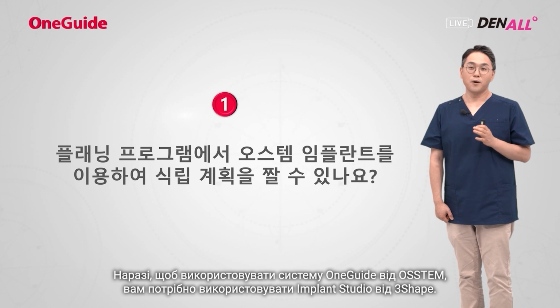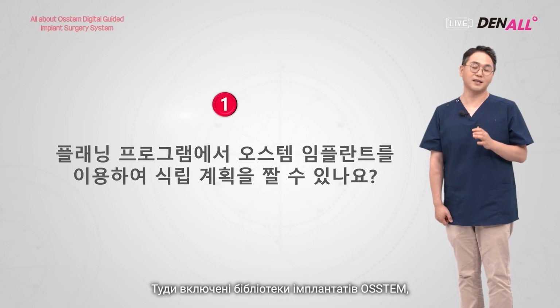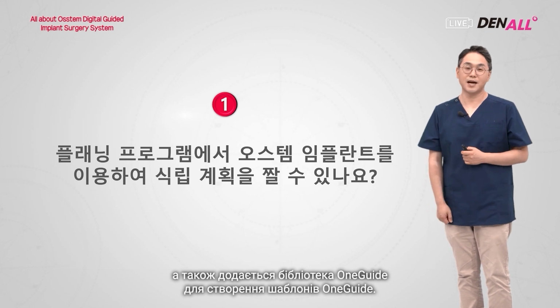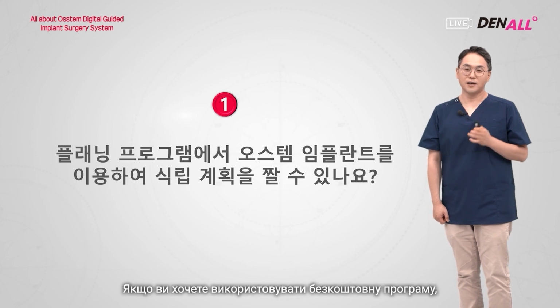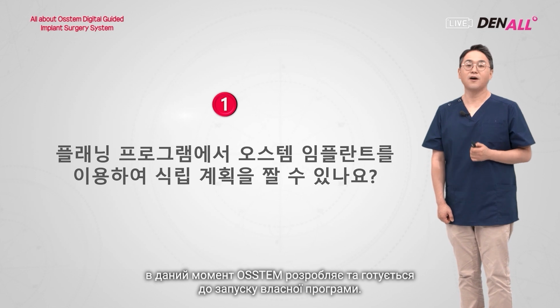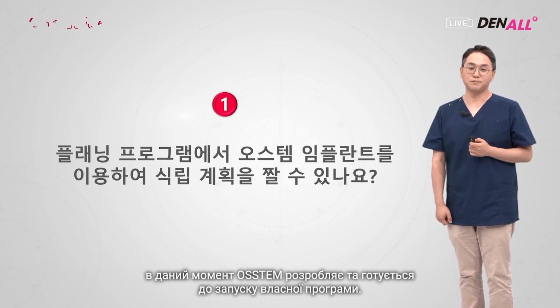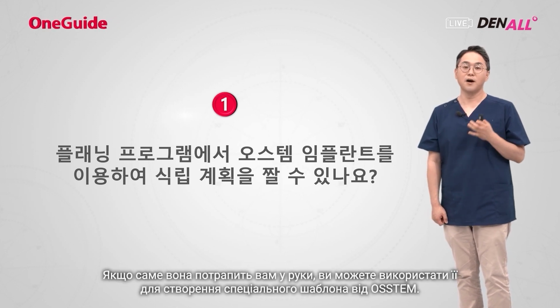For guides, you need to use Implant Studio, and it's expensive. It's a very great program. The Osstem implant library is included there, and the One Guide library to create One Guide is also included. If you want to use a free program, currently Osstem is developing and preparing to launch its own program. If you can get your hands on that, you can use it to make an Osstem dedicated guide.